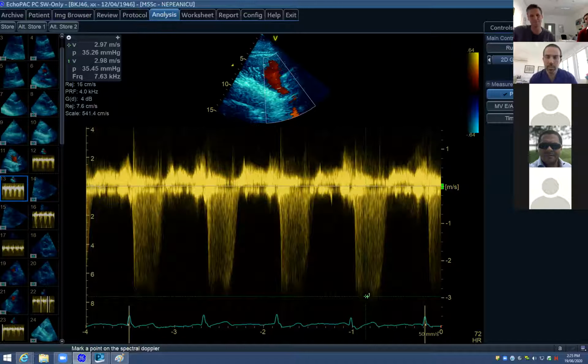It's probably not making a massive difference to what we're going to conclude, but just to make sure that we're measuring it accurately. And that includes, on the Doppler trace, just like you said, having the baseline at the top of the image, filling the screen with 4 cardiac cycles across the screen, not 14 or something, and then just turning down the gain, looking for the modal velocity.